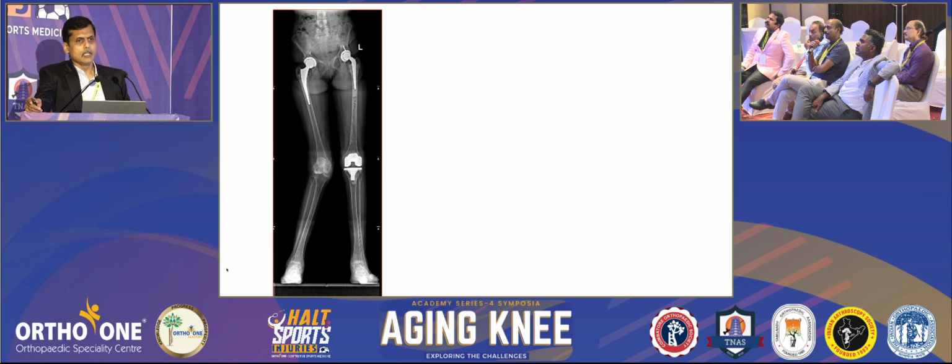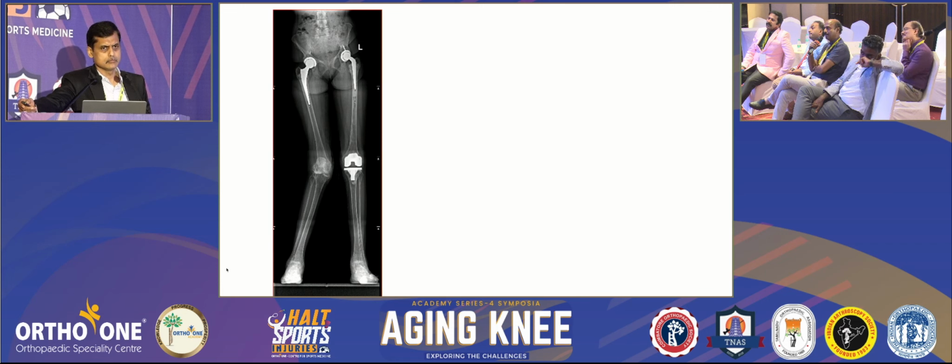Normally we'll do a conventional total knee replacement with a medial approach. A lot of lateral release needs to be done, but I'm very happy to go by the medial parapatellar rather than a lateral parapatellar. The IT band and the lateral structures, the popliteus and all those structures, we need to have a good release. There may be a posterolateral defect, which we need to assess to see how much bone defect there is on the lateral femoral condyle. And I'm sure I would do a straightforward PS knee here.